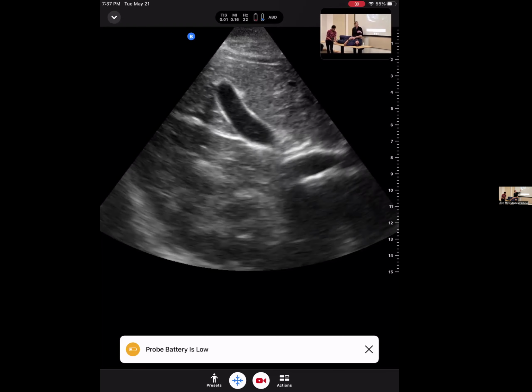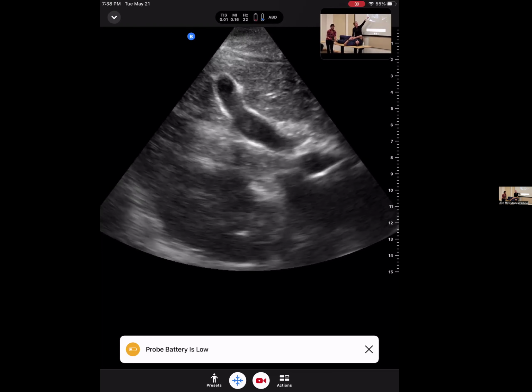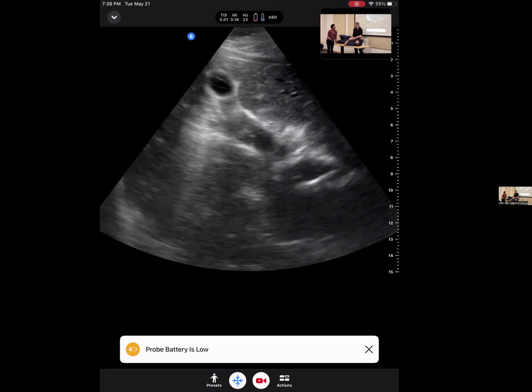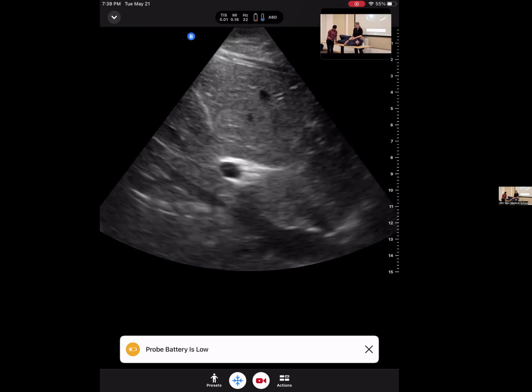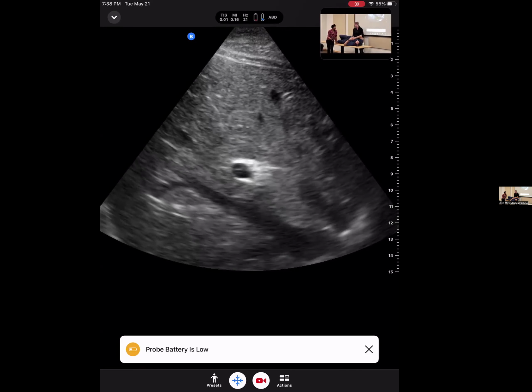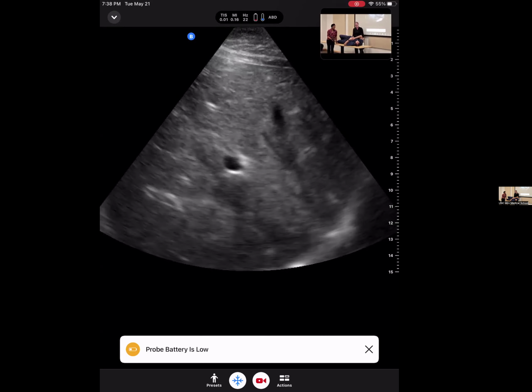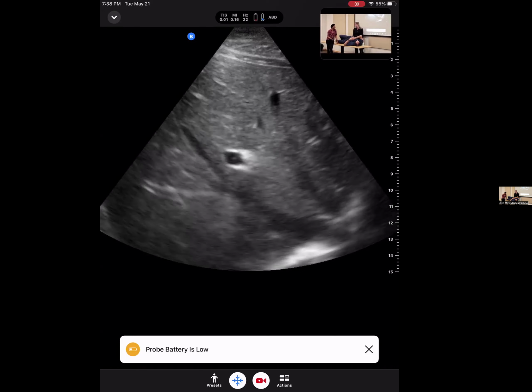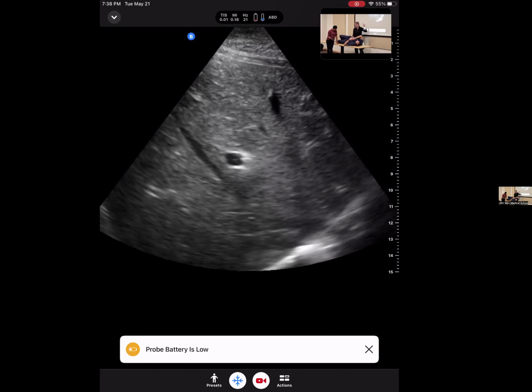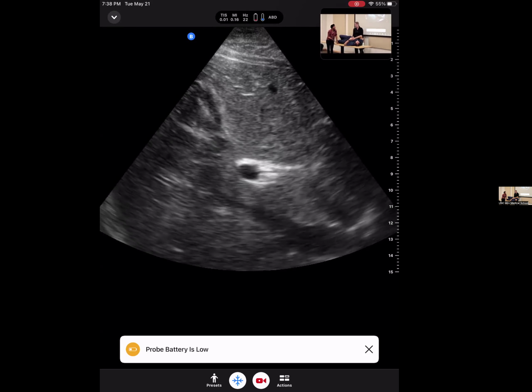The black structure. Yeah, it's a team effort. I can also see things like the vessels and liver. Can you point out the hepatic vein? I'm not testing you. And I can see things in the portal vein, that structure centrally that has really bright walls. I can tell on the ultrasound it's the portal vein because it has different features.